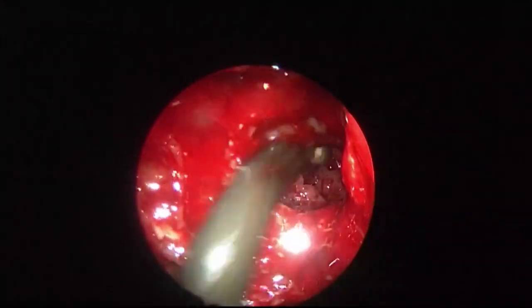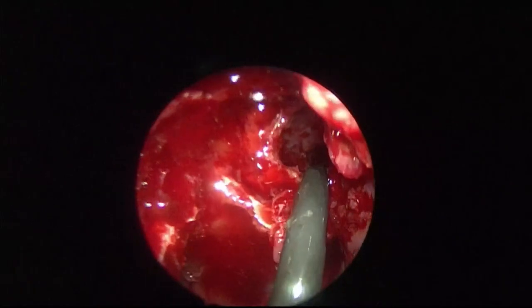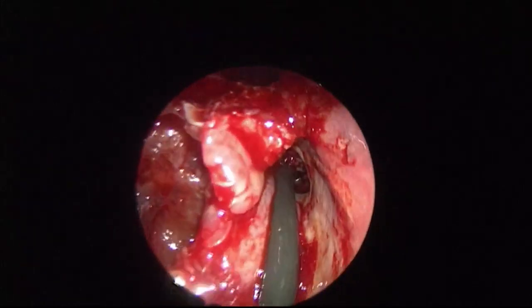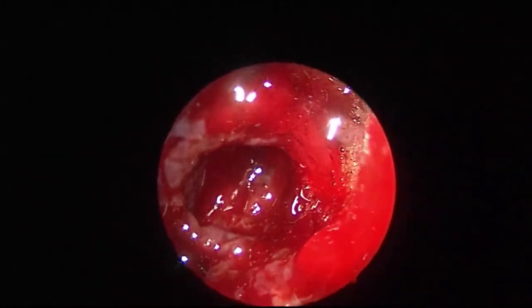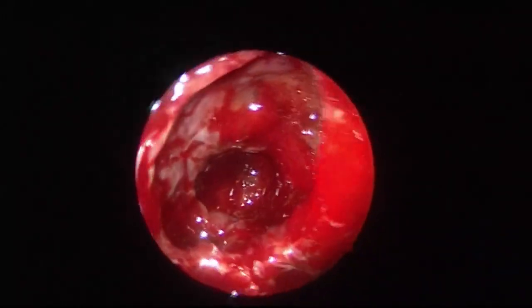There is a question from the audience. They are asking whether a 120-degree scope would be of use here. A 120-degree scope would be of use to see the nooks and corners of the maxillary. This is 70 degree. People are asking whether 120-degree would be useful. Can be. See now the interior of the sphenoid with a 70 degree. Yes, we can see.